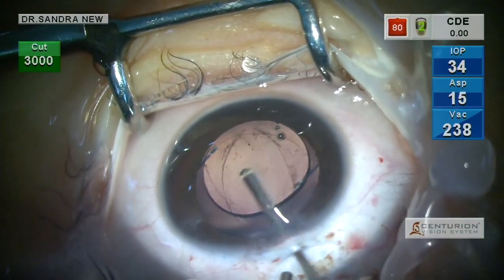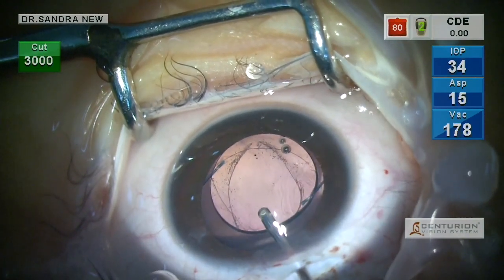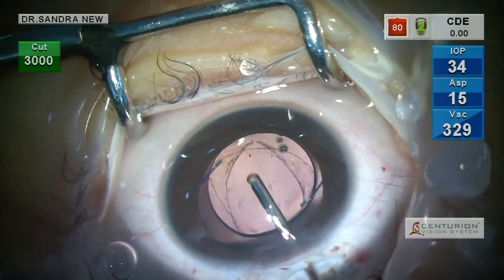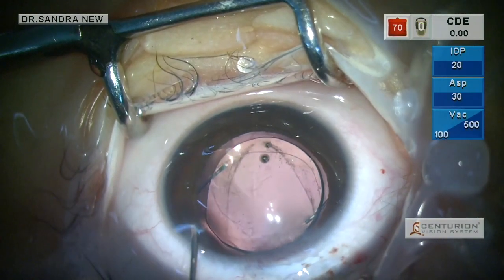An anterior vitrectomy is being done. In pediatric cataract, anterior vitrectomy is always essential in order to prevent membrane formation — otherwise membrane formation would be around 100 percent.